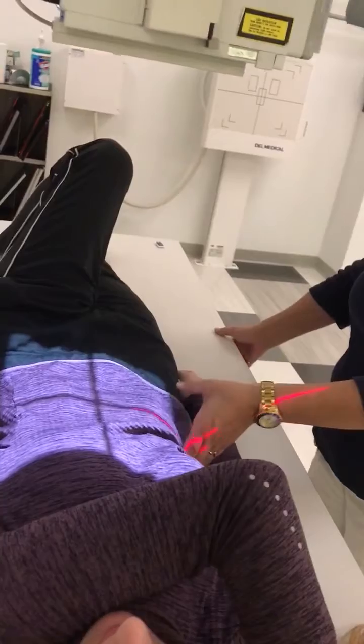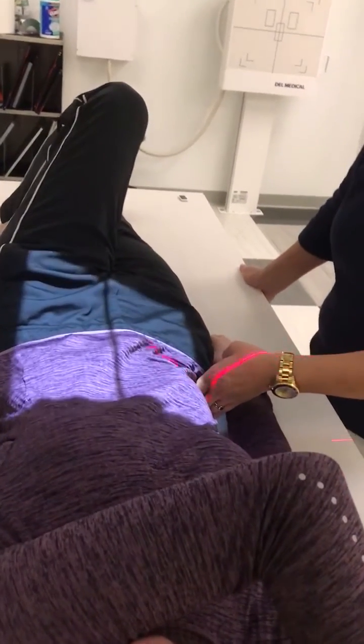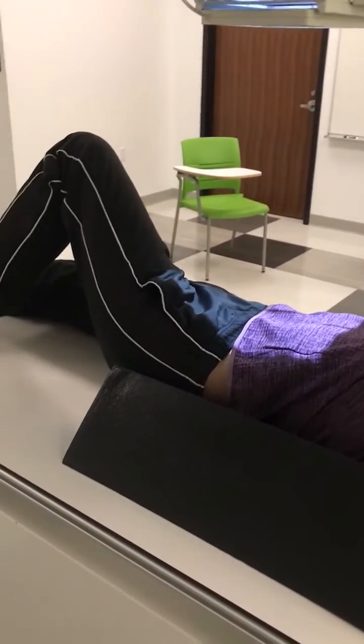I'm also palpating for the iliac crest. I'm centering to the level of the iliac crest. Taking a deep breath. Blow it all the way out. Hold it. Exposure.